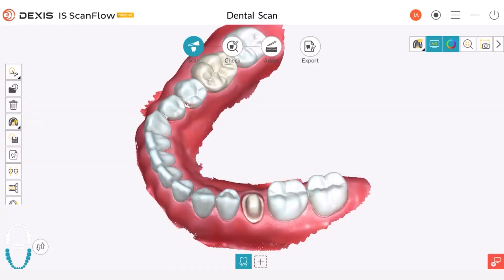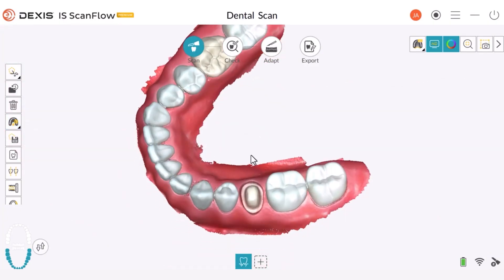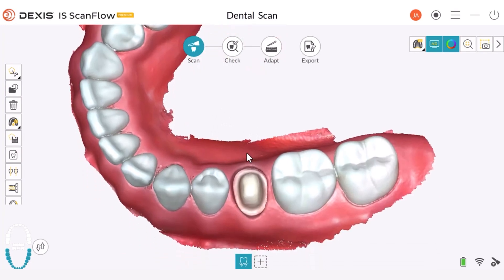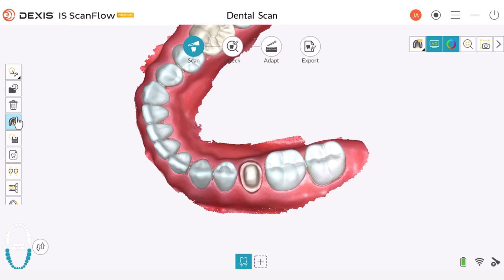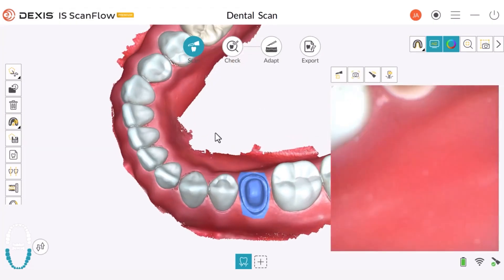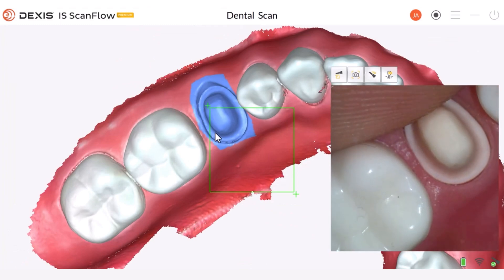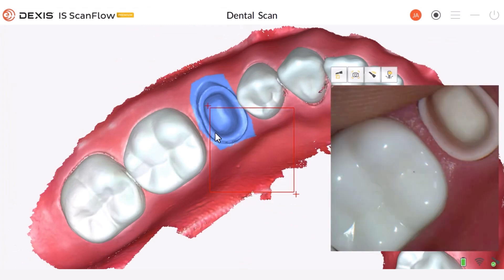I will now connect the scanner to demonstrate how the scanning process will appear when you have marked a locked area. We are going to engage the lock tool and mark an area to lock. Once I start scanning again, the area where my finger is located will not be captured because of the applied lock.